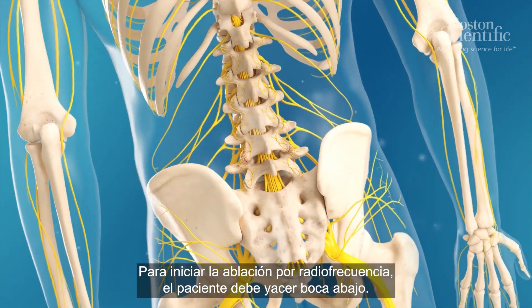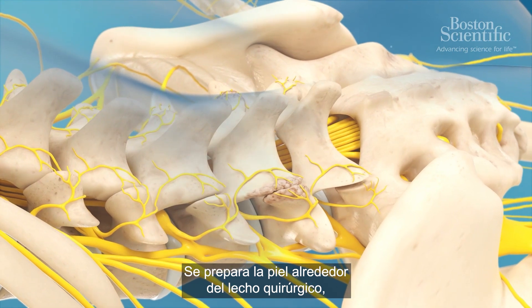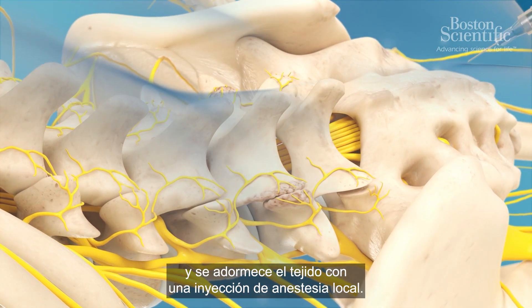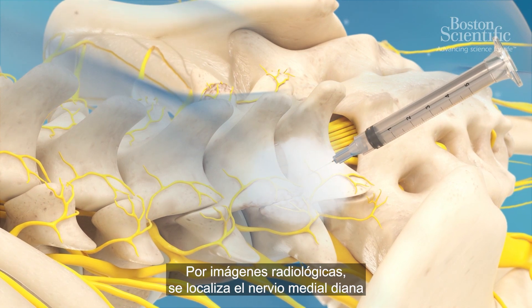To start a radiofrequency ablation, the patient lays face down on the table. The skin around the procedure site is prepped and the tissue is numbed with an injection of local anaesthetic.